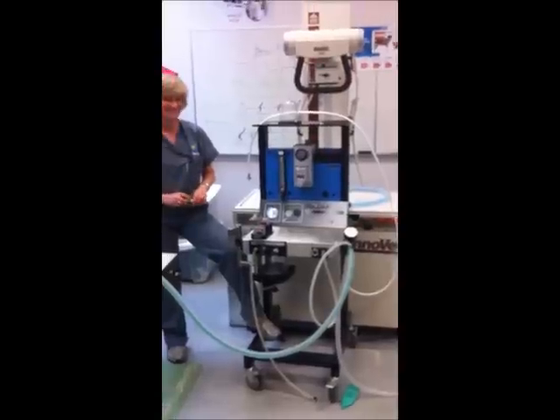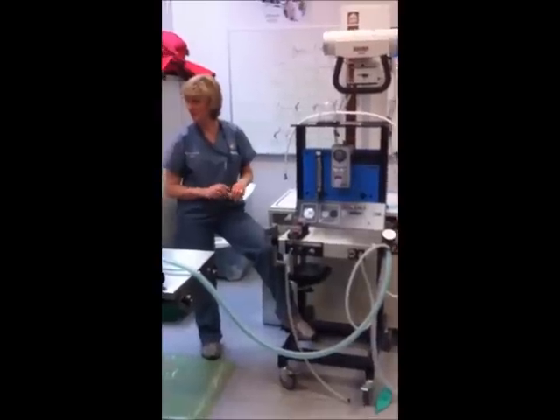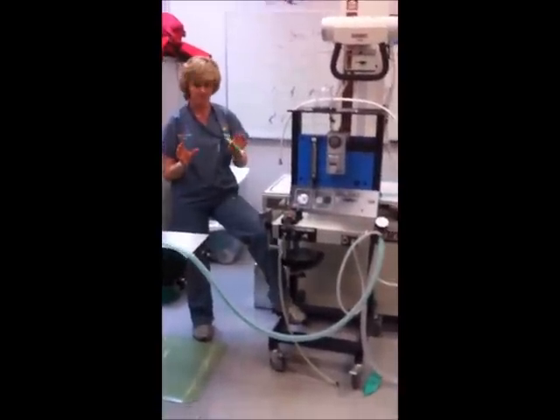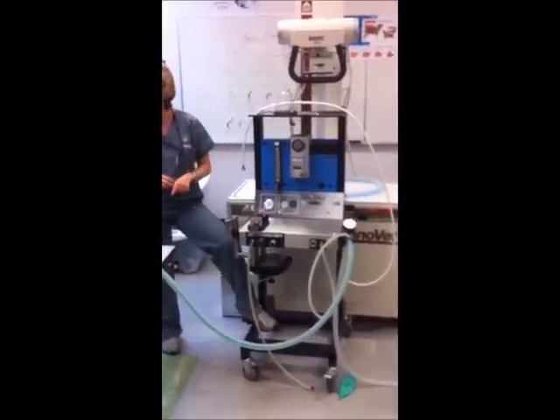Yeah? Are you feeling comfortable with all this? I still get it confused. Okay, well you've got to study that then. Just get your notes, what's the rebreathing, what's the non-rebreathing, and go over them until it's clear in your mind.